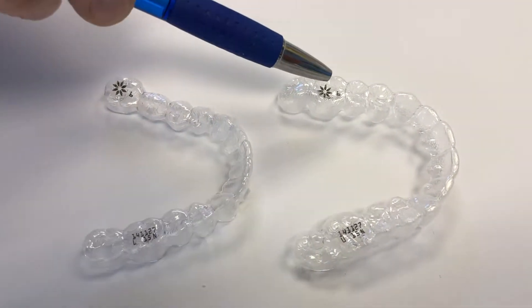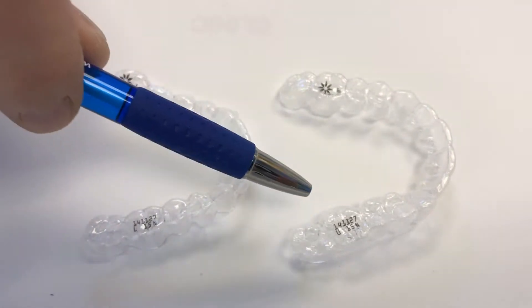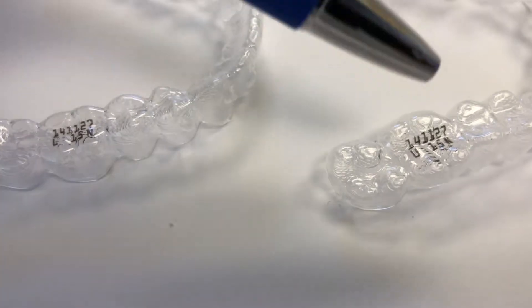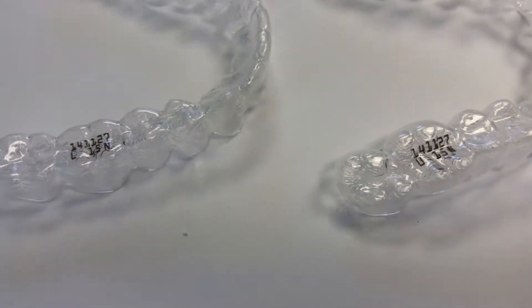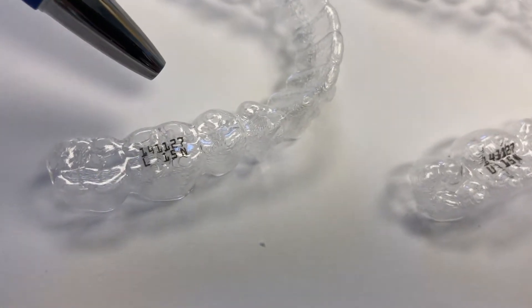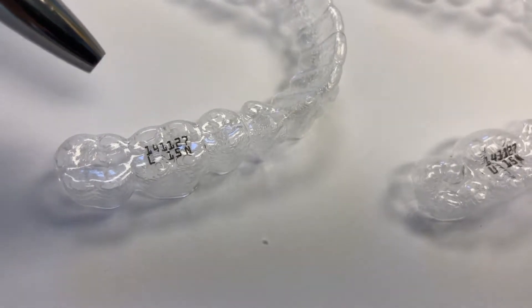There's an Invisalign logo on one molar, but the opposite molar will have an Invisalign patient ID number. On this case, it's a U designating the upper tray, and 15N means number 15. The opposite tray has, again, an Invisalign logo, but a patient ID number on the opposite molar with an L15N. The L means lower, and 15N means number 15.